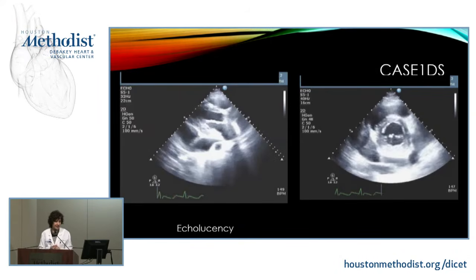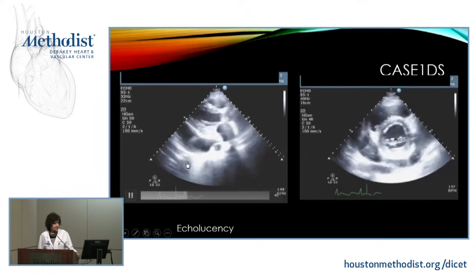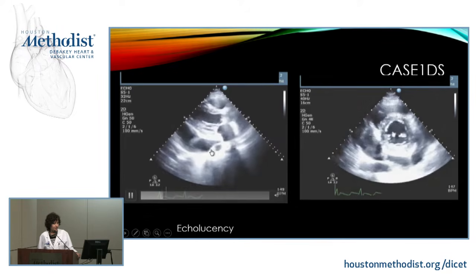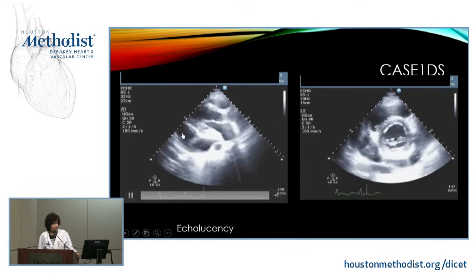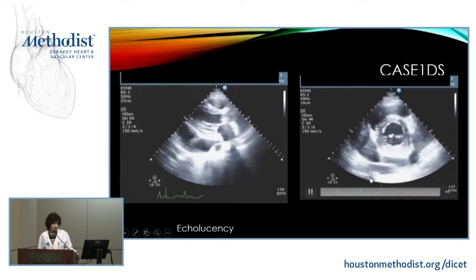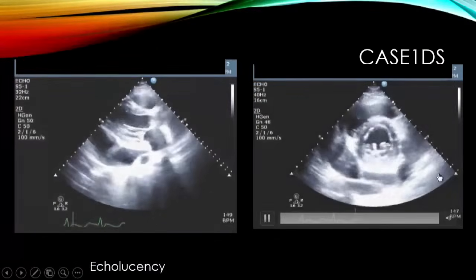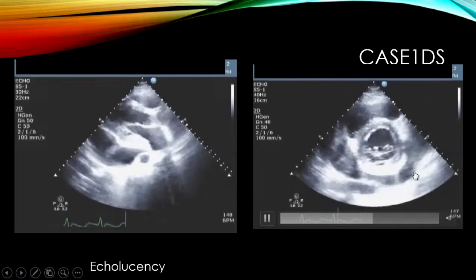And this is the first case. This is a patient in the echo lab. We see this echo, and we are looking at it. You can see there is echolucency and a collection of fluid around the cardiac chamber. This is your descending thoracic aorta. The fluid stops right before it, so you know this is a pericardial effusion. Again, you're seeing it in short axis, and you're seeing how it nicely tracks the cardiac silhouette here. This is a pretty large effusion.